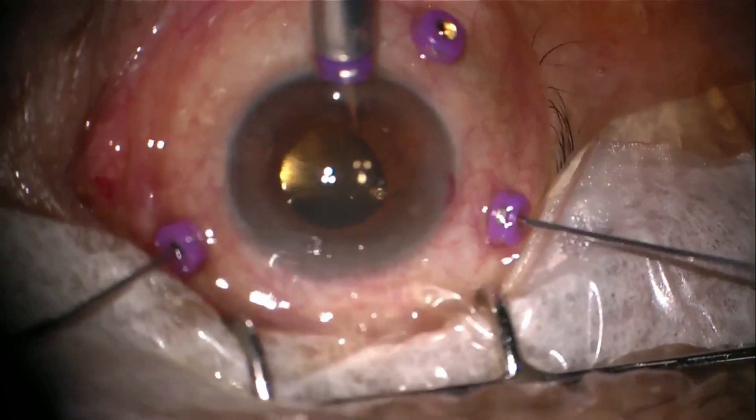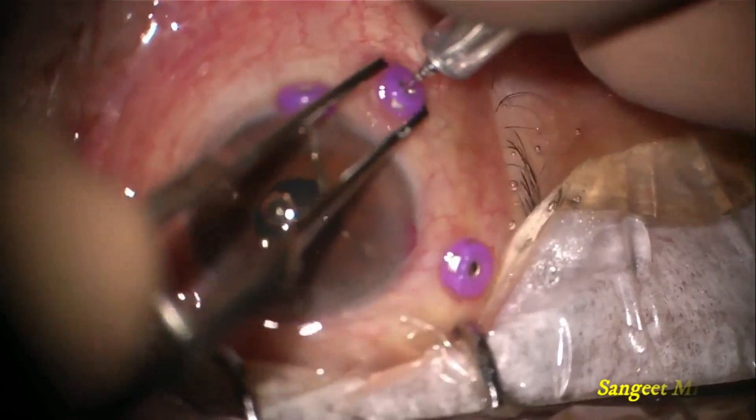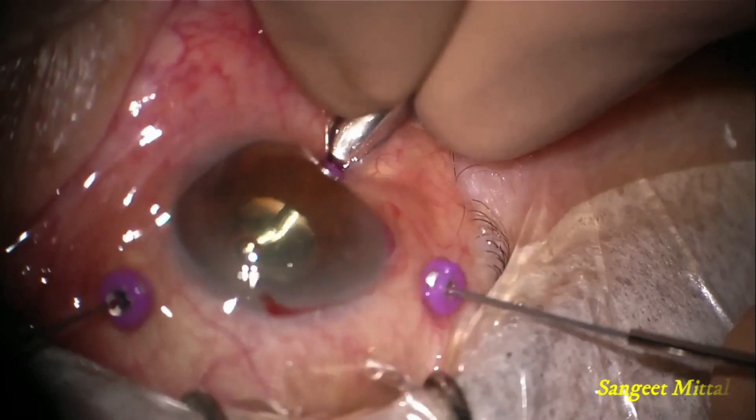To begin, the infusion was placed in the anterior chamber to drain out the hyphema. Anterior vitreous was removed and it was confirmed that the infusion cannula was in the vitreous cavity. Vitrectomy with base excision was then performed.